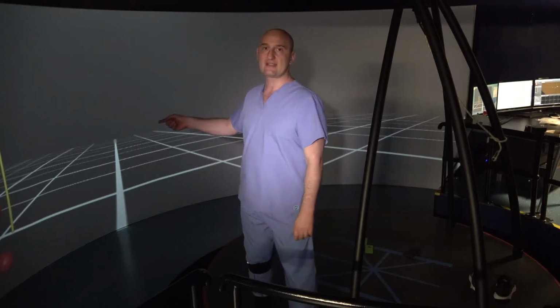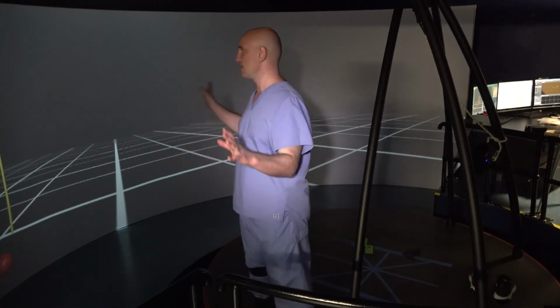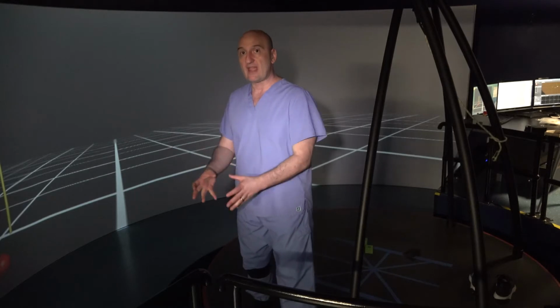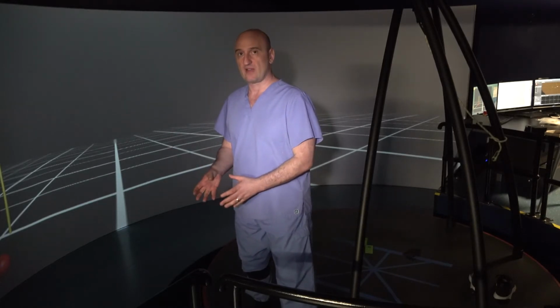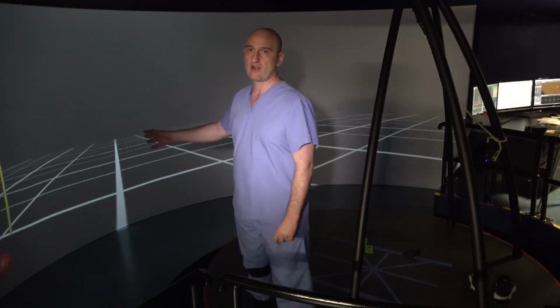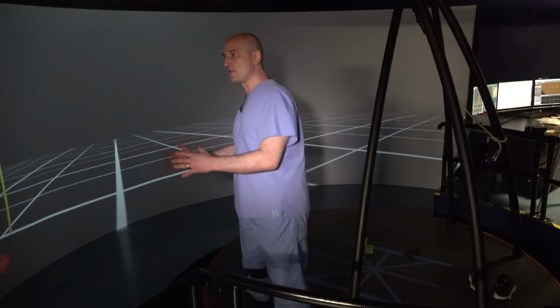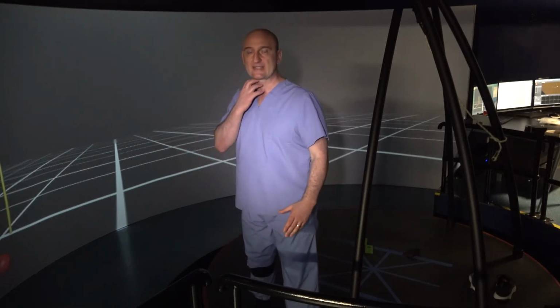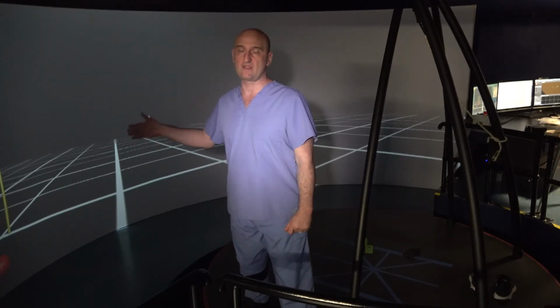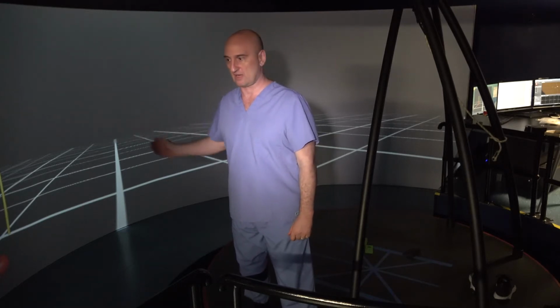Then we can take this kinematics and insert it into an application. The CAREN system has multiple applications, and we can take one joint, if we want to provide feedback, and insert that into an application. We have a variety of applications: the person could be walking up and down a hill, could be driving a boat, a variety of different scenes. And we can trace and give real-time feedback, particularly to the knee, let's say, in this case that I'm going to demonstrate.